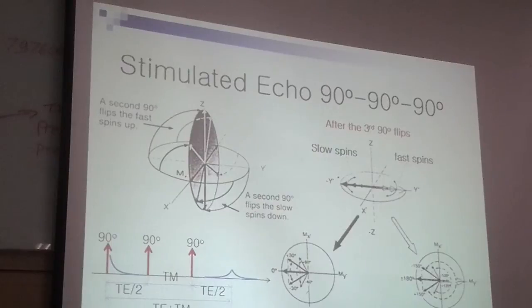This slide shows another RF echo. Using the combination of three 90-degree RF pulses, a kind of RF echo is also generated here.